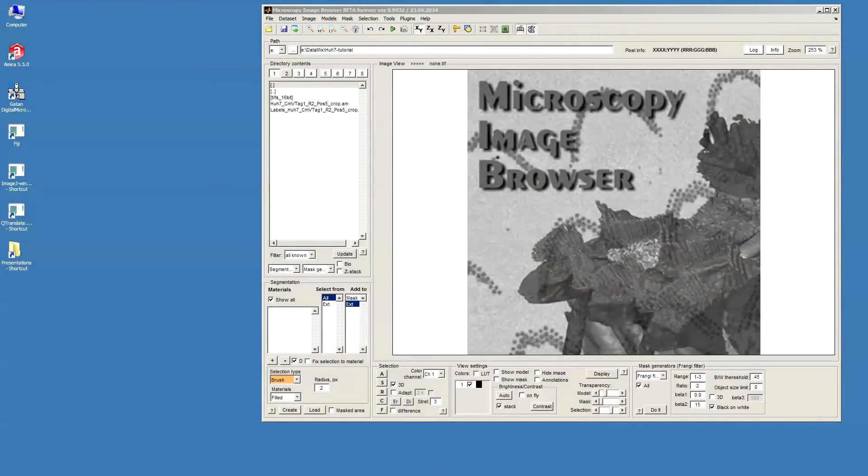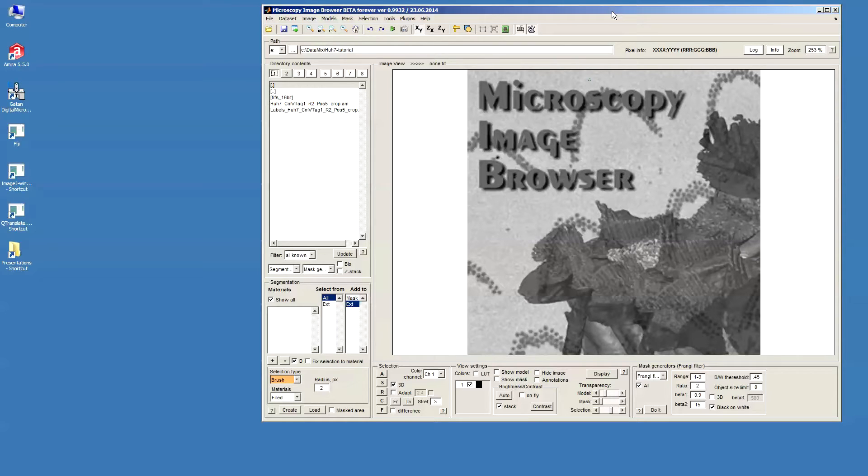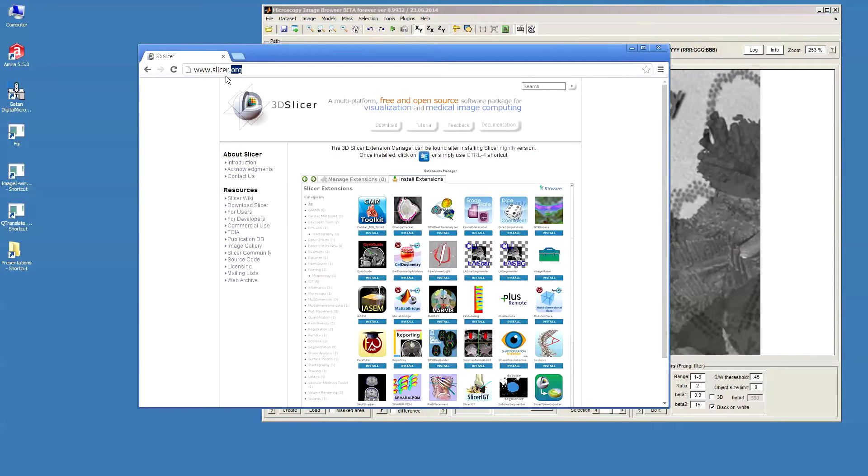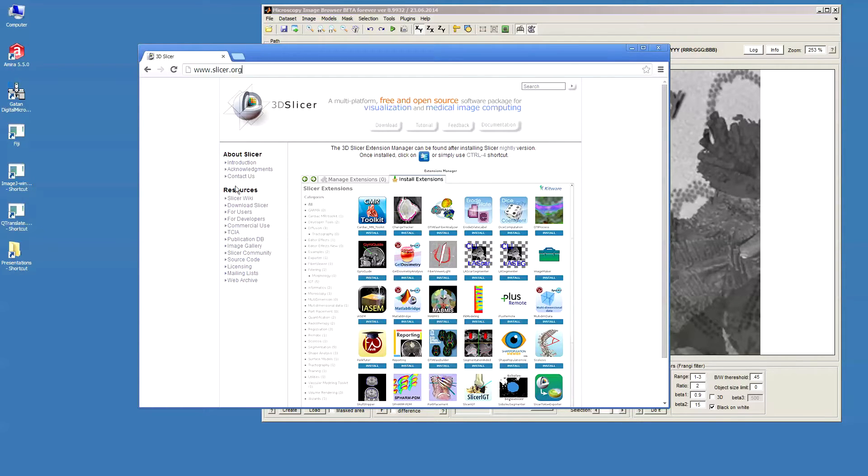Hello, this is a tutorial about image visualization using 3D Slicer. 3D Slicer is a free program available for download from www.slicer.org and it allows quite nice visualization of 3D datasets.